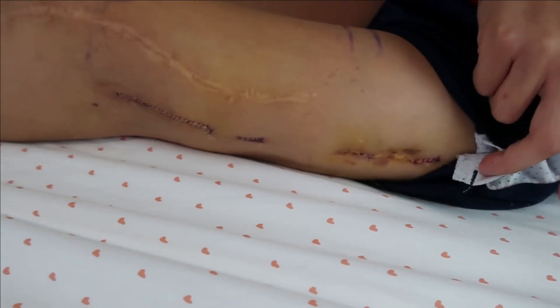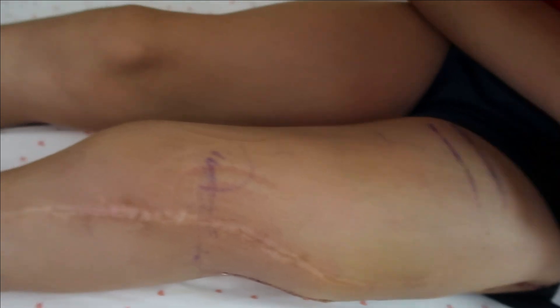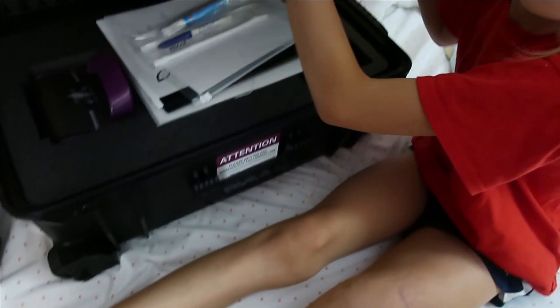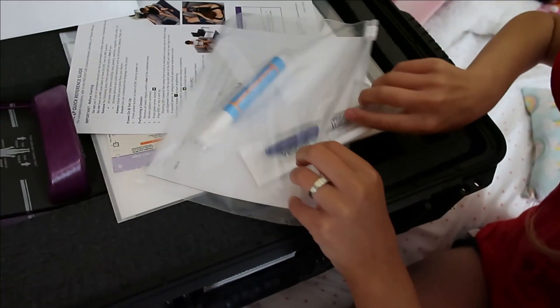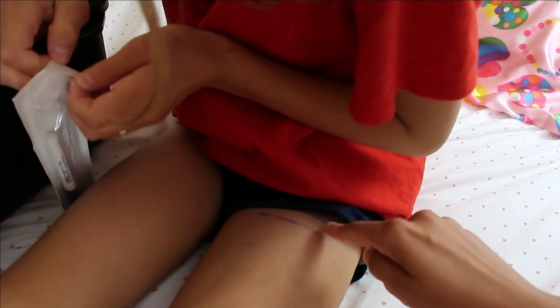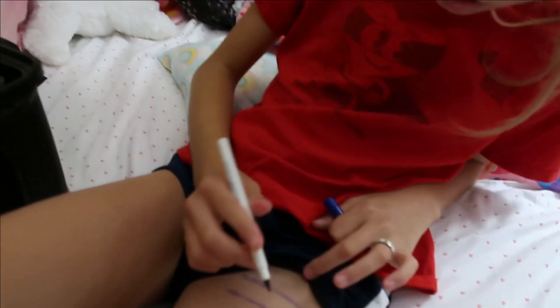Here's Elsie's leg with all of her incisions out. We're about to mark on her leg again, and we'll show you guys why that's important. Inside the kit we get a manual on how to use this. We also had a representative from the company come show us. This is our skin marker. We have to make sure Elsie always keeps this mark on her leg — we cannot let that go away. So as it fades, as she bathes, we will continue to draw it. We're going to let Elsie draw.